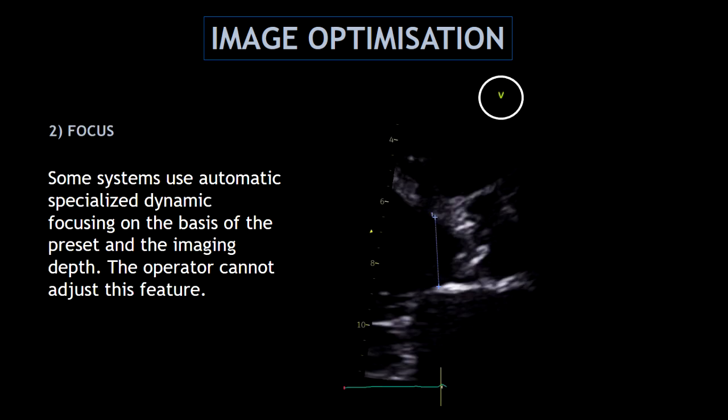Some systems use automatic focus and the operator cannot adjust this feature.